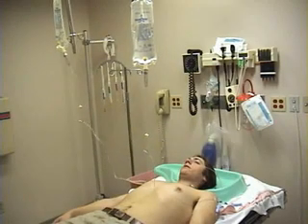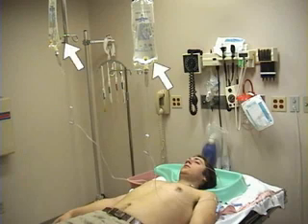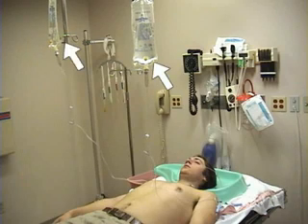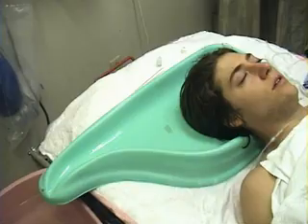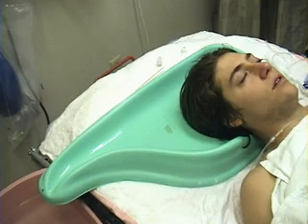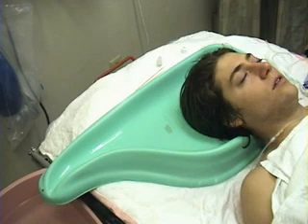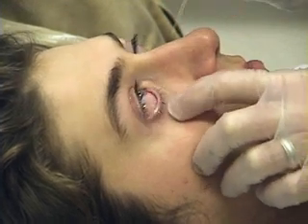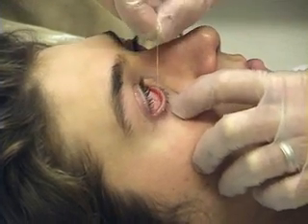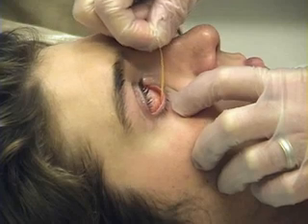Place the patient supine on the stretcher. Hang the bags of saline irrigation fluid several feet above the patient's head. If available, a plastic drainage bin may be used to collect the irrigation fluid.